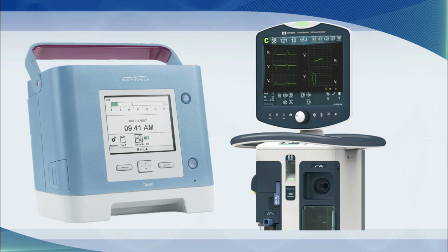Non-invasive ventilation can be delivered by purpose-built machines such as the one on the left, that's the Respironics or Philips Trilogy, or the one on the right, that's an ICU ventilator. All non-invasive ventilators can deliver CPAP, but not all ICU ventilators can do so. The Puritan Bennett 980 requires a mode that gives a little bit of pressure support.